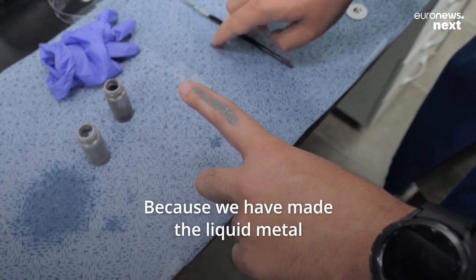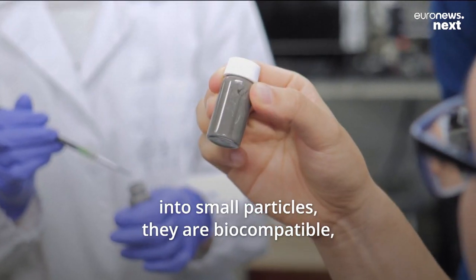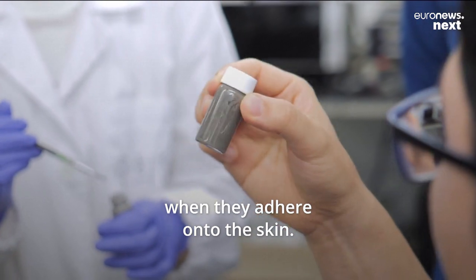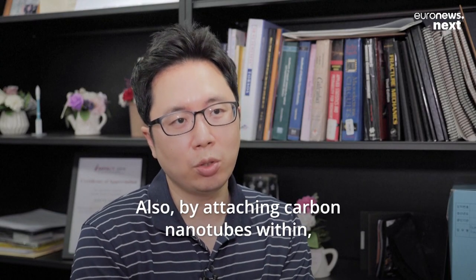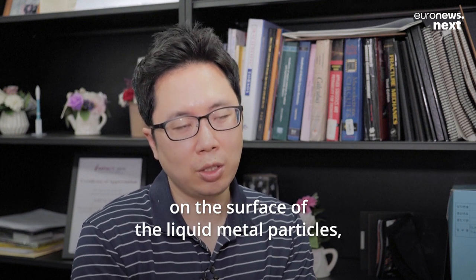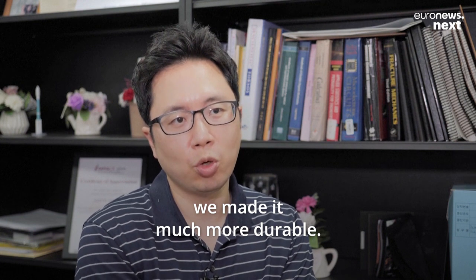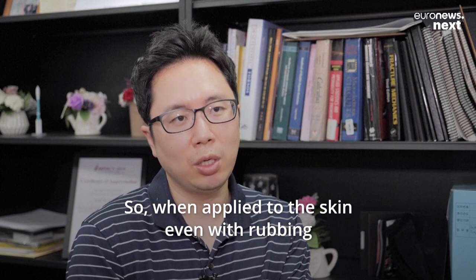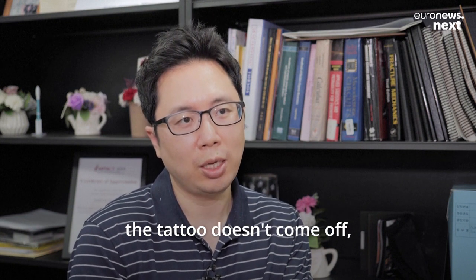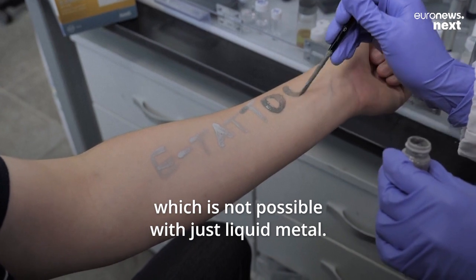Because we have made the liquid metal into small particles, they are biocompatible when adhered onto the skin. Also, by attaching carbon nanotubes on the surface of the liquid metal particles, we made it much more durable. So when applied to the skin, even with rubbing, the tattoo doesn't come off, which is not possible with just liquid metal.